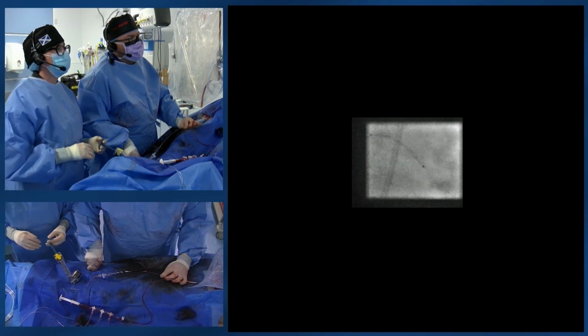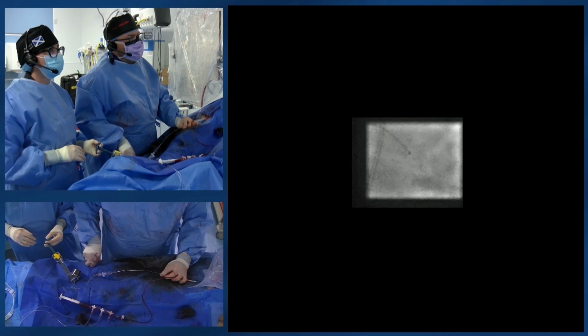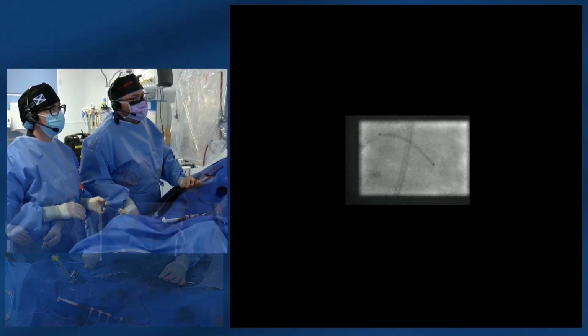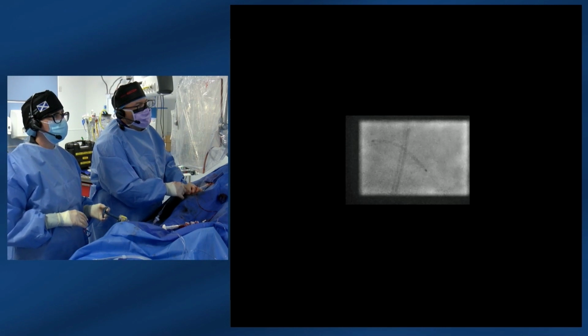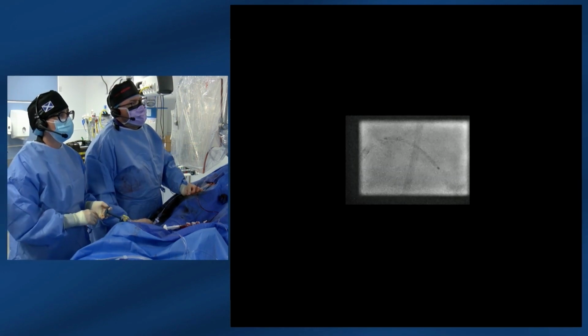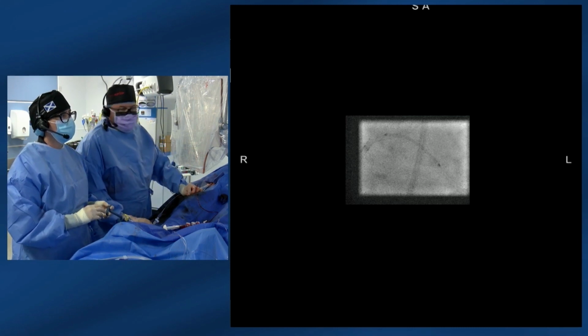So we'll just center up. You can see we've got a nice small... So it's very important you see both dots of the balloon, because that's what guides the elastic registration for the PCI Assist software. So looking there, I might just go in a dot, Margaret. What do you think? Yeah, certainly you've got enough length, I think. Okay, can we just center that just so we see the proximal dot? That's good.